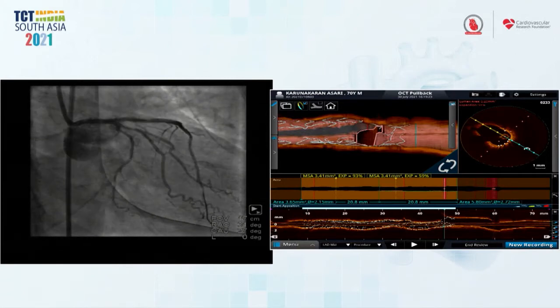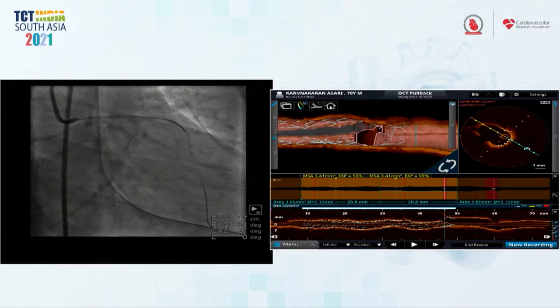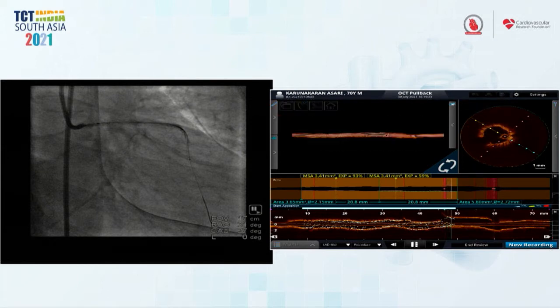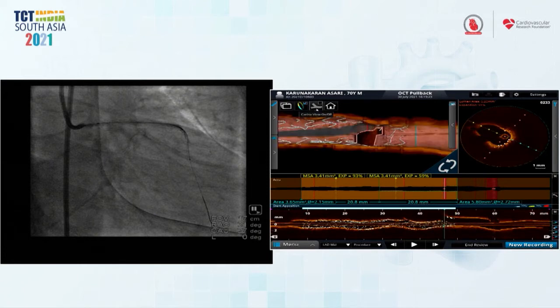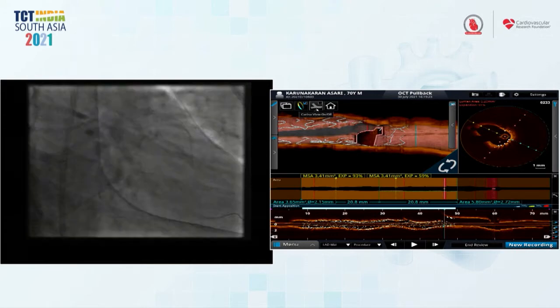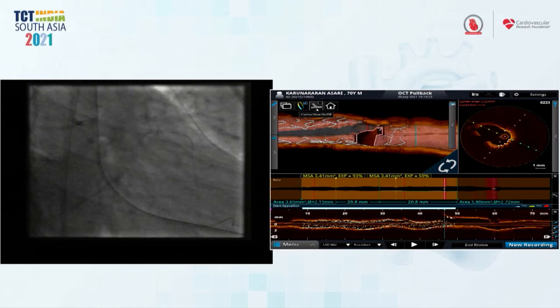I can tell you we have some burgeoning data, the EuroIntervention data that you published, that shows once you put in a second stent, if the patient has a stent failure, they're done. Nothing works. And you're talking about a lot of complexity, a lot of expense. So I try to avoid putting a second layer of stent if at all possible. So you think it is negative remodeling? Just leave it after this balloon dilatation, Jia?